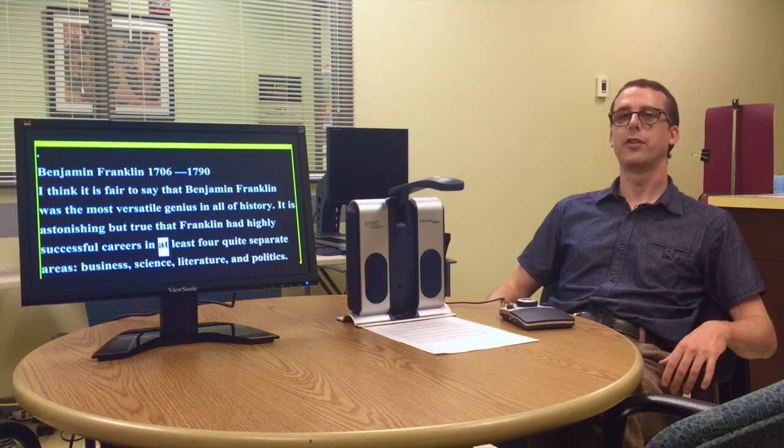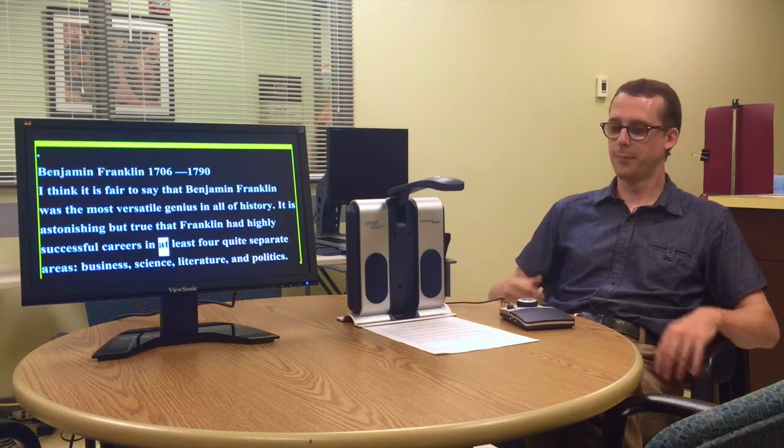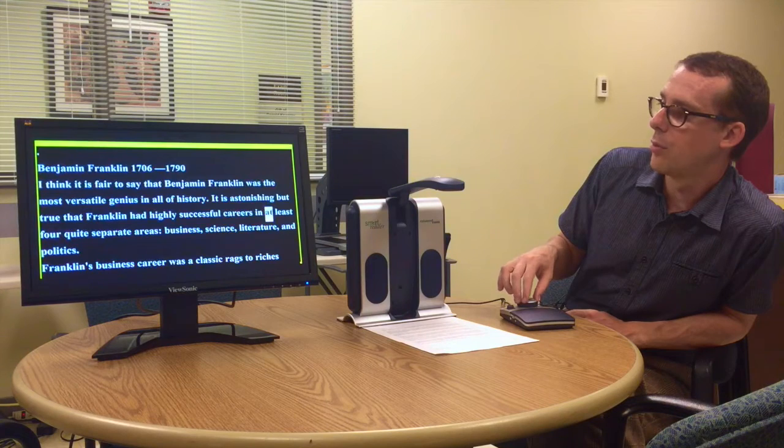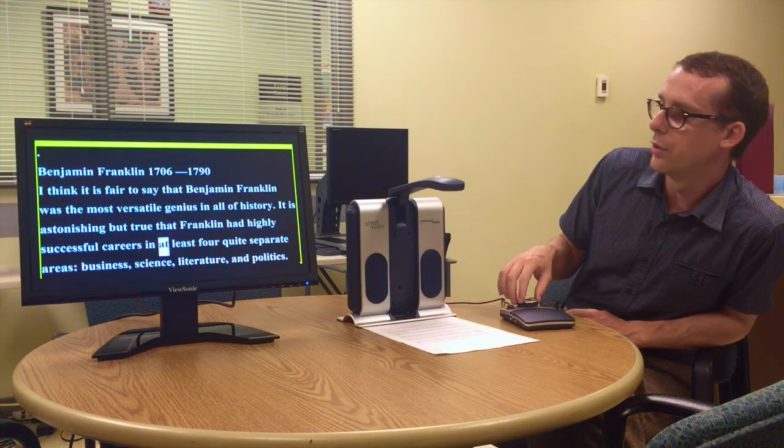It also displays the text that it's reading on a screen if we have it connected to one, like I do here. If we do have a screen connected, we can adjust the size of the text using the control panel, so if we need to make it smaller or larger, we're able to do that.